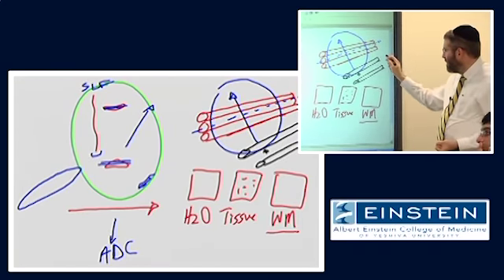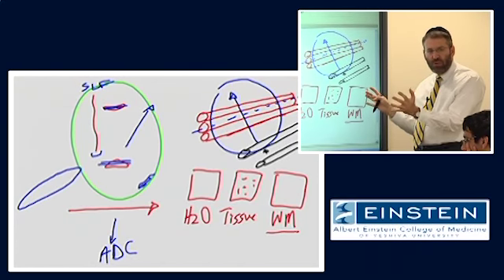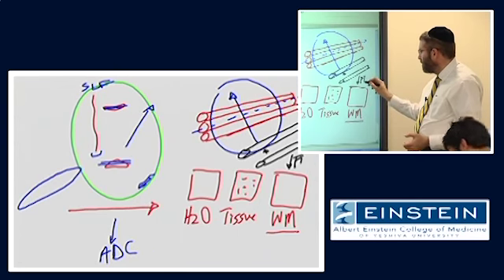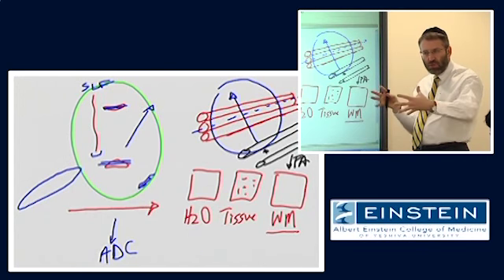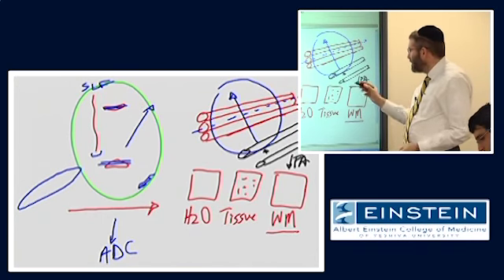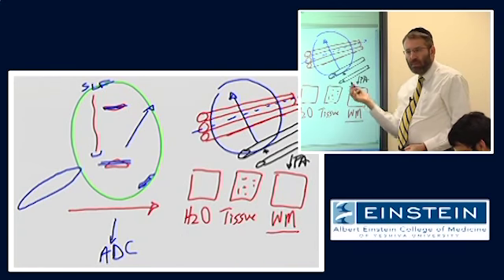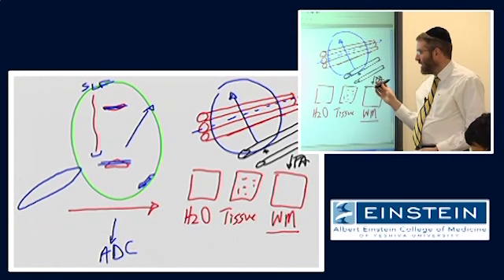Right? So this appearance would give us a much broader spectrum of directions of diffusion. This would be a lower fractional anisotropy. That diffusion ellipsoid would become much shorter and fatter because of the increased components of diffusion that are not along the direction of the path of the axons.